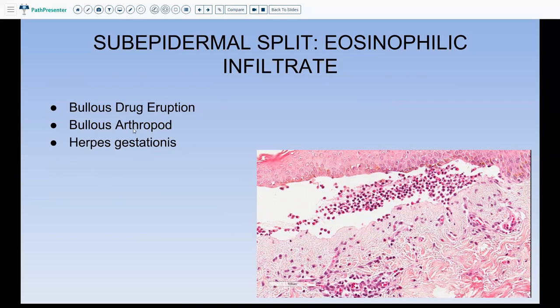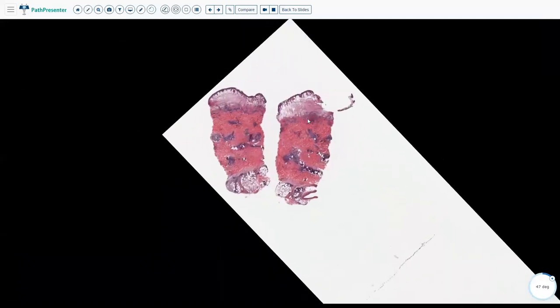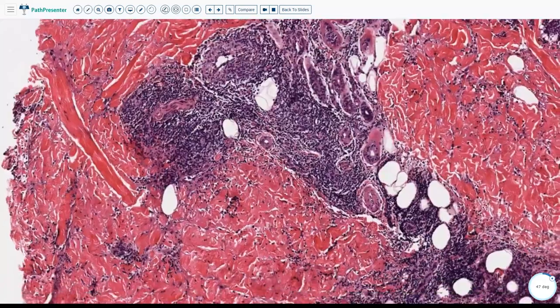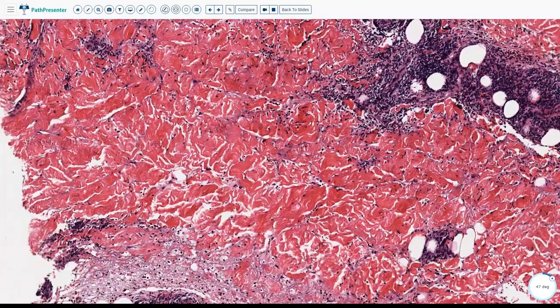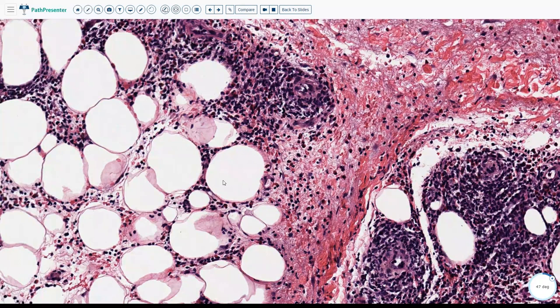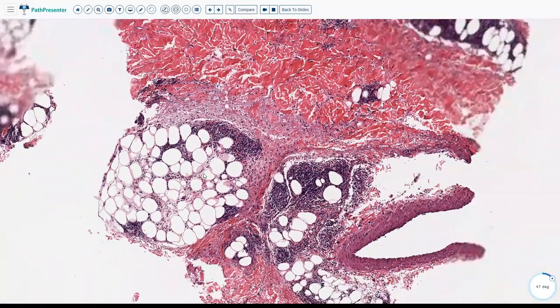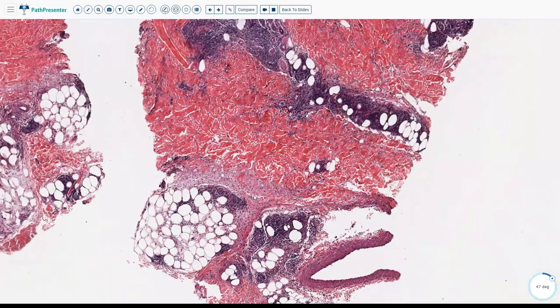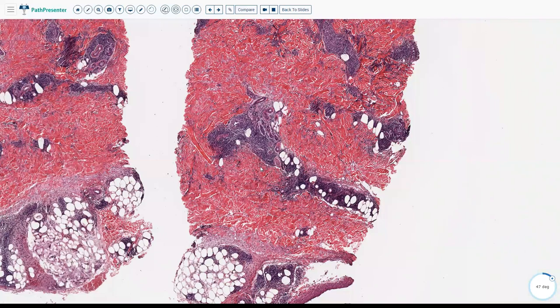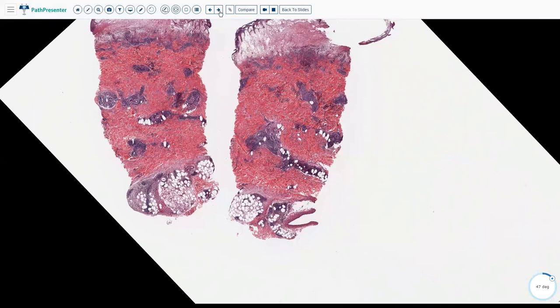Bullous arthropod bite and bullous drug eruption can show a similar picture. In a bullous arthropod bite, you see a sub-epidermal split, a lot of dermal edema, and perivascular interstitial inflammation composed of lymphocytes and a ton of eosinophils going quite deep. An observation: if eosinophils extend into the subcutis, this favors an arthropod bite reaction. Sub-epidermal split with significant eosinophilic inflammation — consider bullous pemphigoid, herpes gestationis, bullous drug, and arthropod bite.